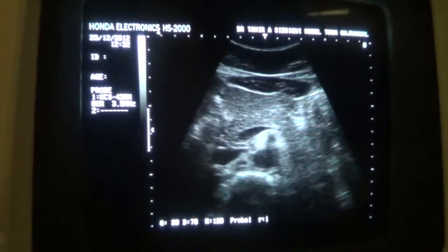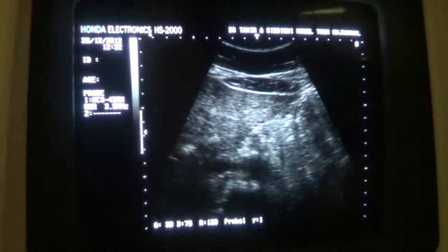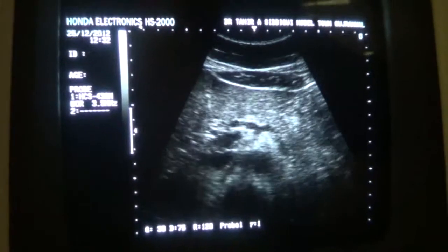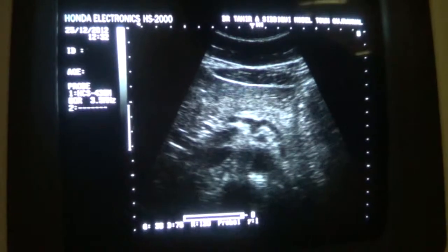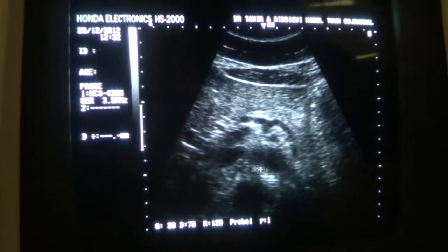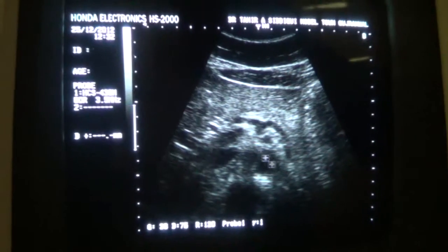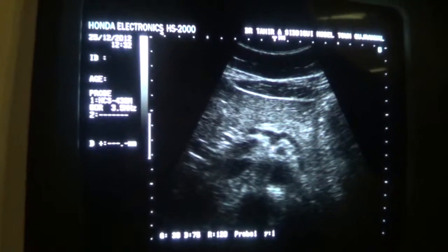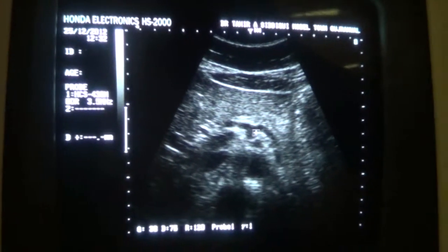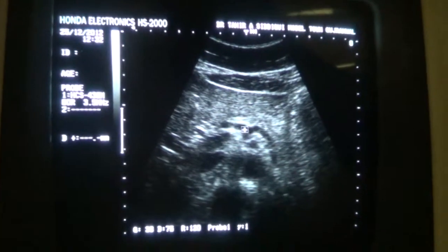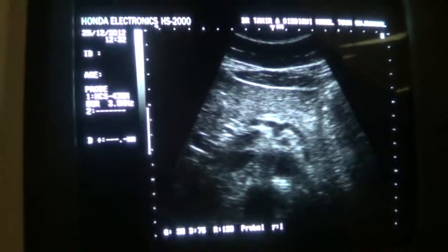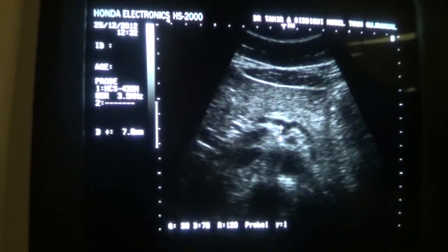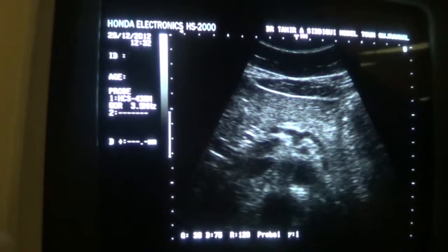Now, when I move the probe a little downwards and then angle it upwards, I see two vessels arising from this celiac axis. This is the aorta, this is the celiac, this is the IVC, this is the portal vein, this is the superior mesenteric artery. And this small area up to this one is the celiac axis, celiac artery, celiac trunk.